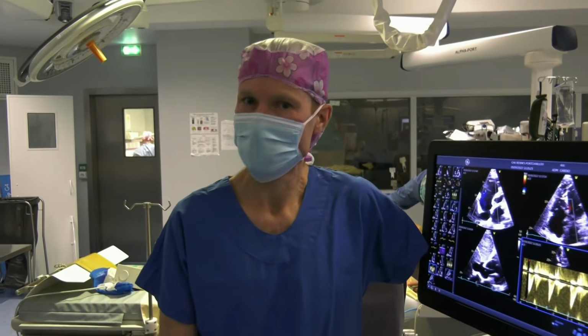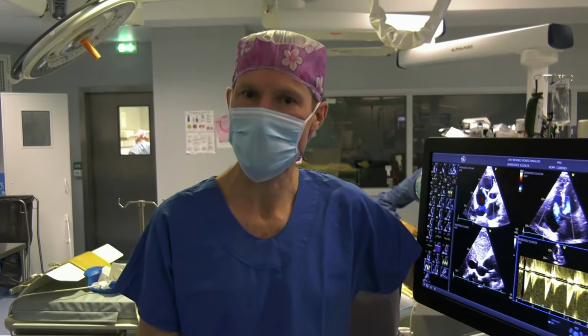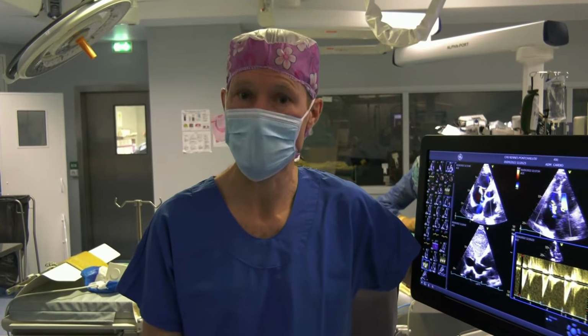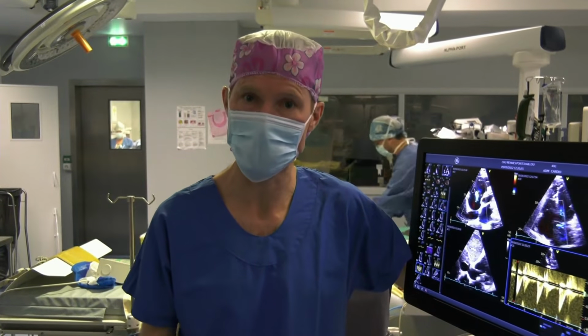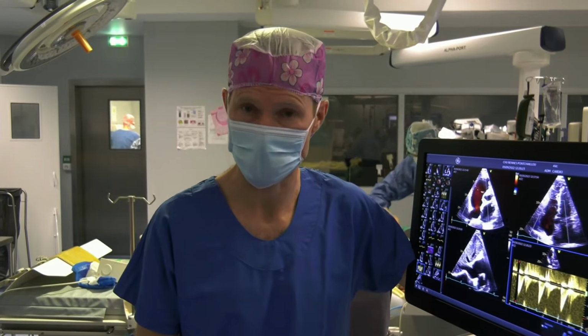Welcome to the Rennes University Hospital. We will deal today with a patient with a tricuspid regurgitation. The idea is that we have to treat this tricuspid regurgitation with clips because the patient is still symptomatic despite the fact that we optimized the medical treatment, and the diuretics especially.